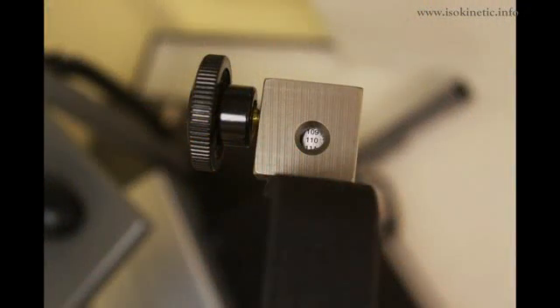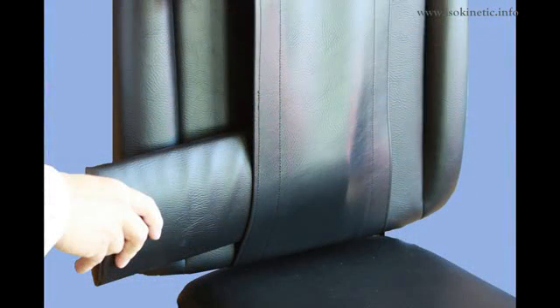Move the handle to position 109. Finally, place the lumbar cushion onto the chair if required.